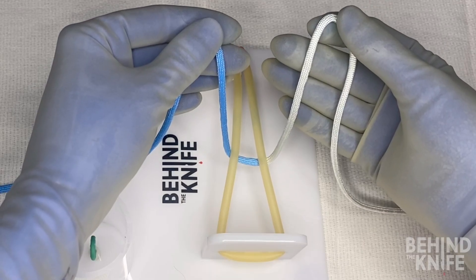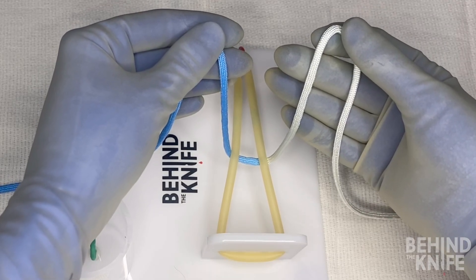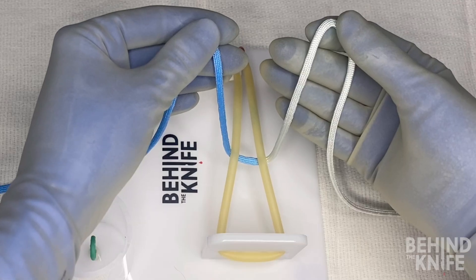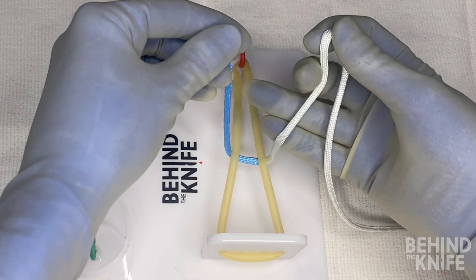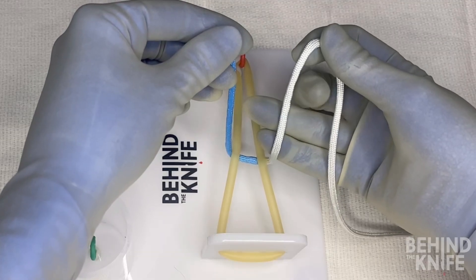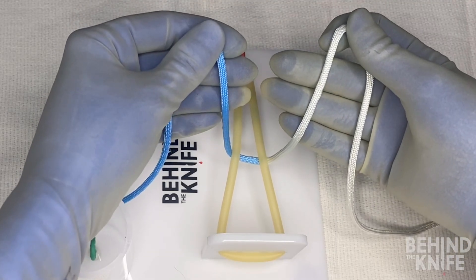No worries if you're left-handed — we have a video to demonstrate a left-handed one-hand knot tie as well. The key to making this knot is going to be hooking your index finger around the string, which can seem a bit confusing at first, so we'll start off slow.